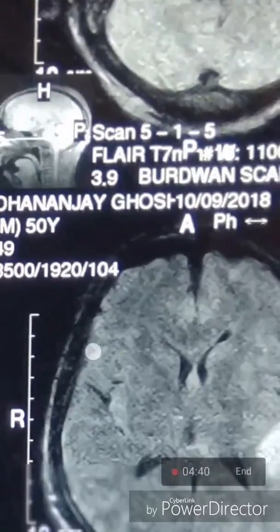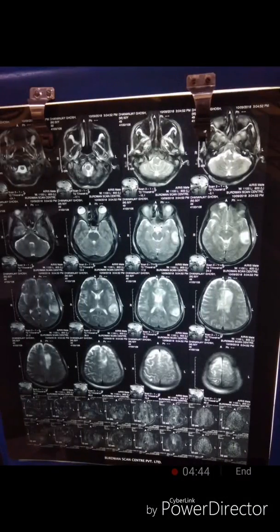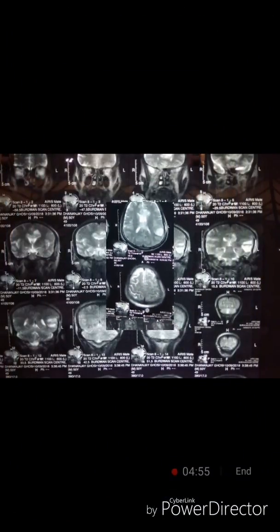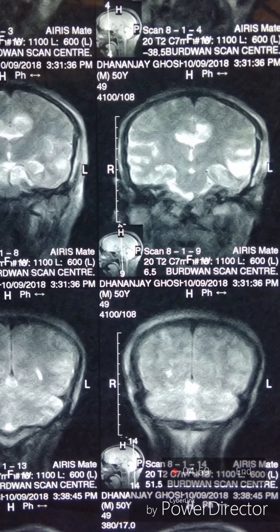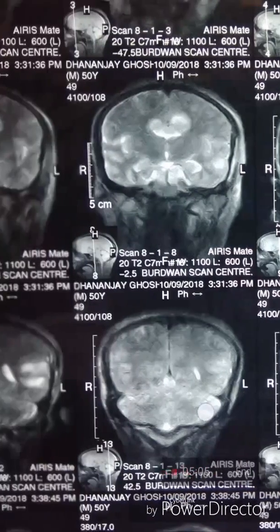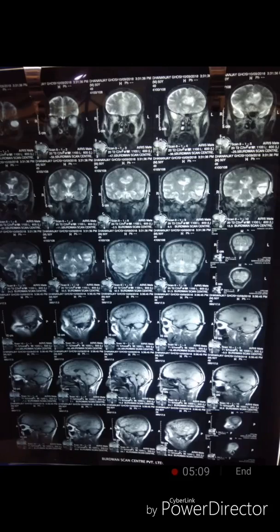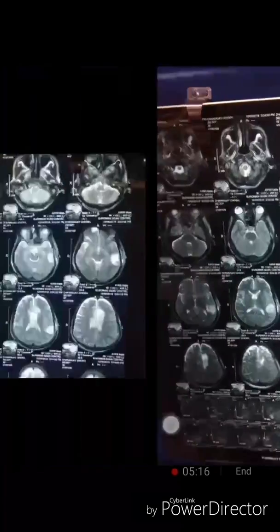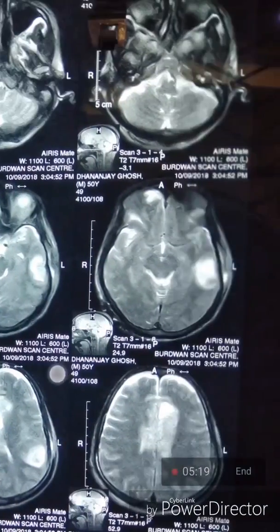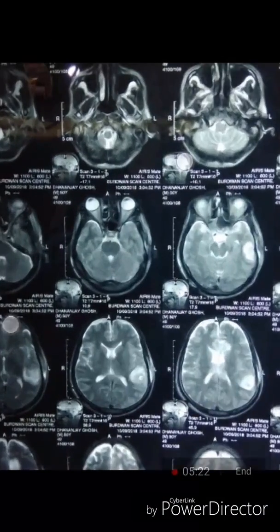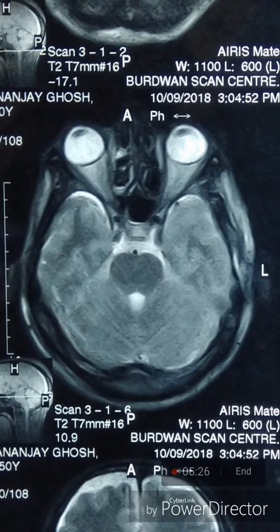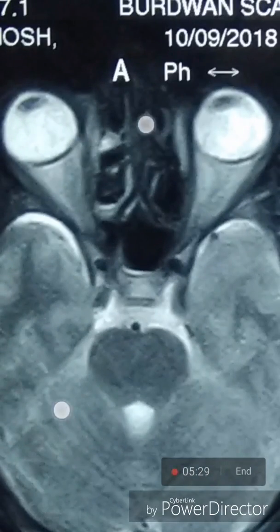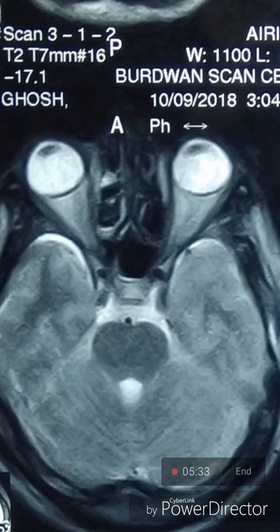The cerebellum is quite looking normal. From the posterior aspect, the cerebral hemispheres and the cerebellum look quite normal. The eyeball and the optic nerve are also looking normal, with no pathology seen over that area.